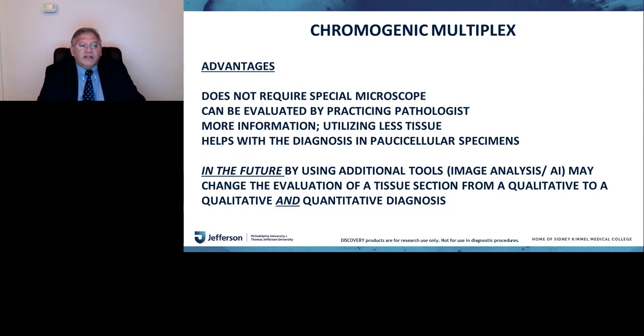The advantages are that you don't require a special microscope. You don't require to be in the dark. This is something that can be evaluated very easily by the practicing pathologist. So even for research purposes, this could be a very nice collaboration between researchers and practicing pathologists.